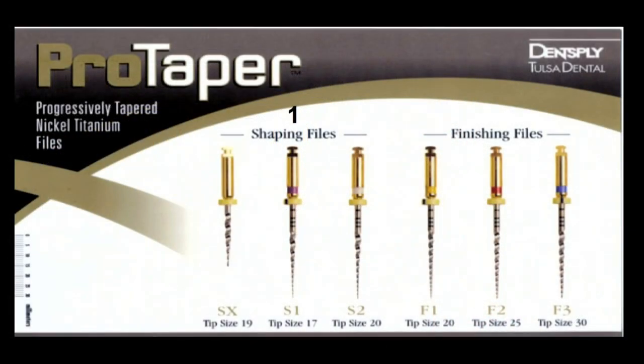And basically, we have one shaper to remove the coronal and restrictive dentin, shaper 2 for the middle restrictive dentin, and then connect the dots with the finishing files. On the left is SX, which is a highly exaggerated progressive instrument, short, for short teeth, or for uprighting dentinal triangles on any tooth.